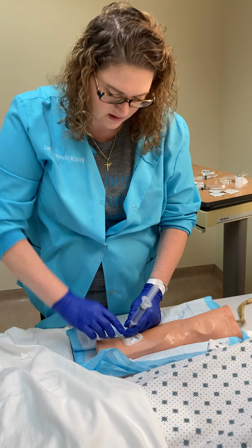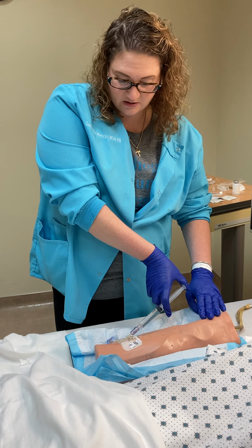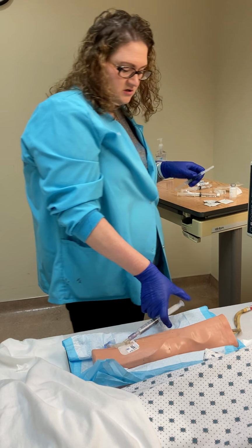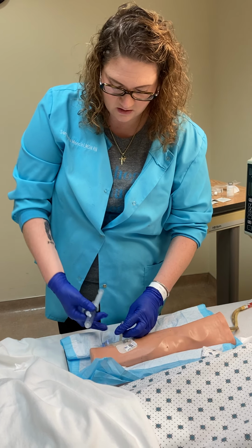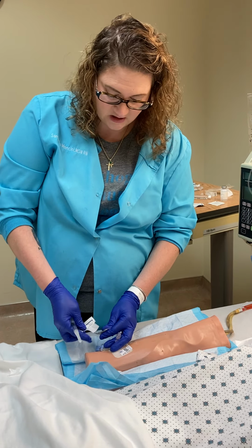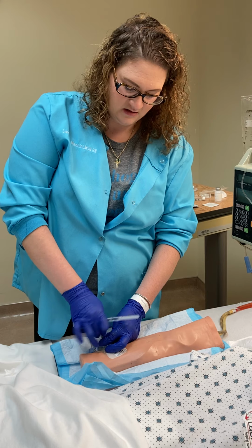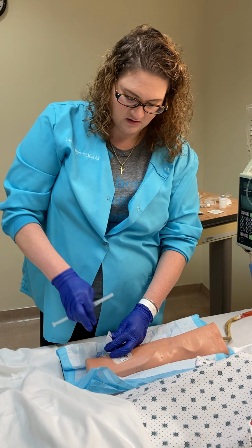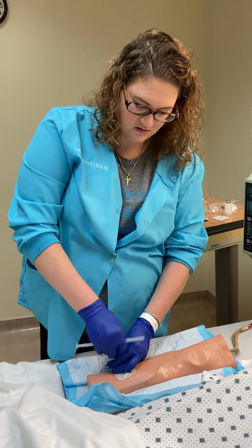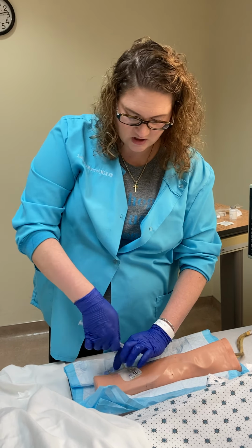Let it dry. I'm going to aspirate for blood return. Like I said, after 24 hours, you might not get blood return on a peripheral. I'm going to flush with, say, 2 to 5. This is going to go in the sharps. I am going to get a new swab and clean for 15 seconds. And allow that to dry.